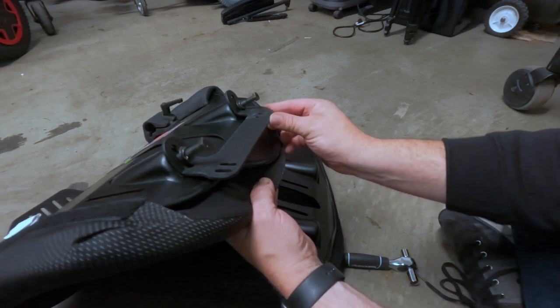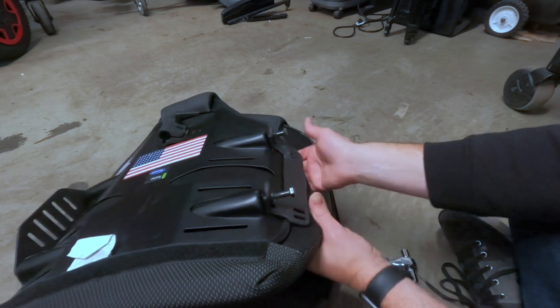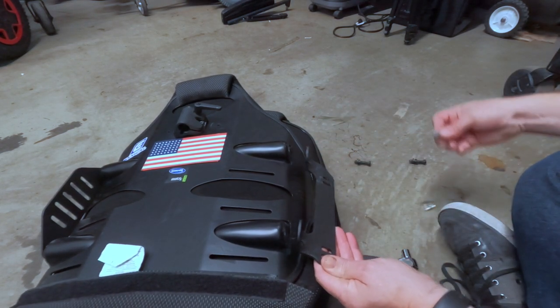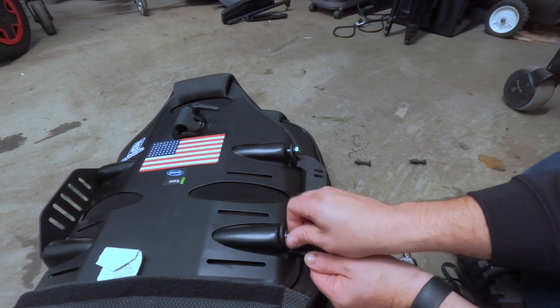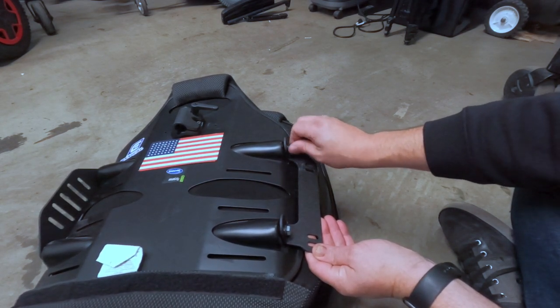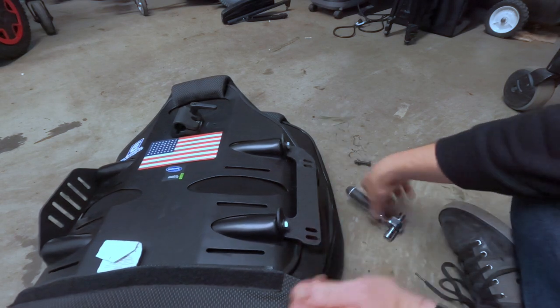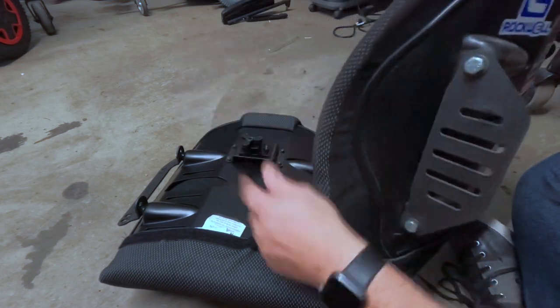Without the spacers there isn't a whole lot of clearance, although I think that should be all right. Wait — these are shoulder bolts. Let me switch to the other ones I've prepared, which are actually on this other chair. You only have certain adjustment points, so it's entirely possible that putting these on may require a little bit of space or adaptation — the width adjustments go in half-inch increments maybe, or one inch, but it may not line up perfectly.